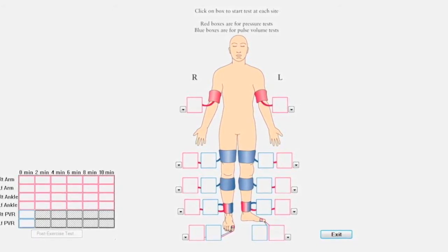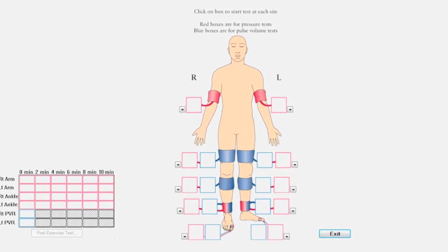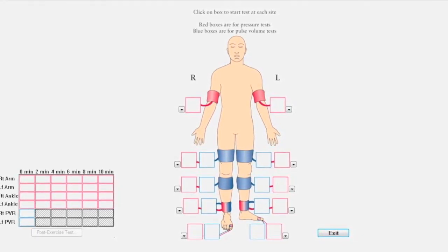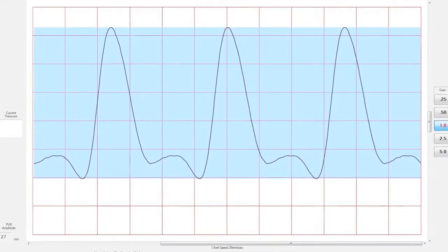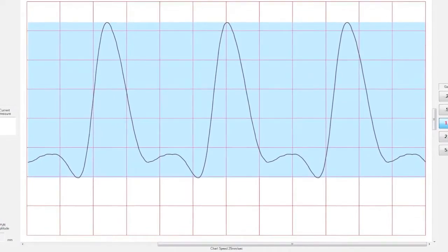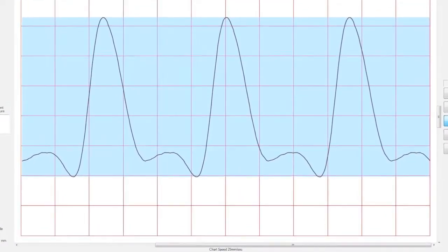Test alternating sides to allow each limb resting time between cuff inflations. Move on to pulse volume recordings, or PVRs, down the lower limb segments.